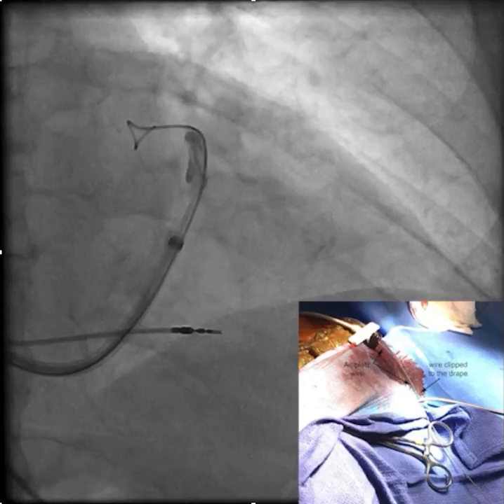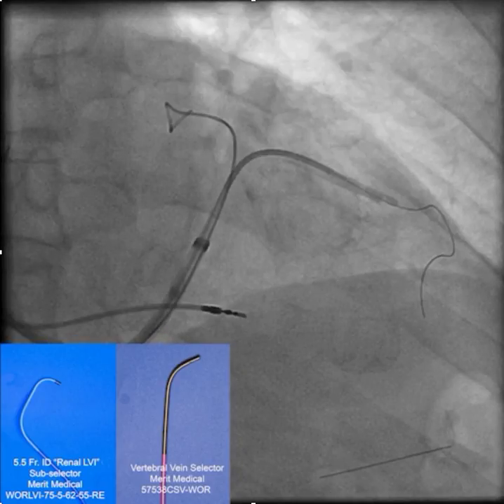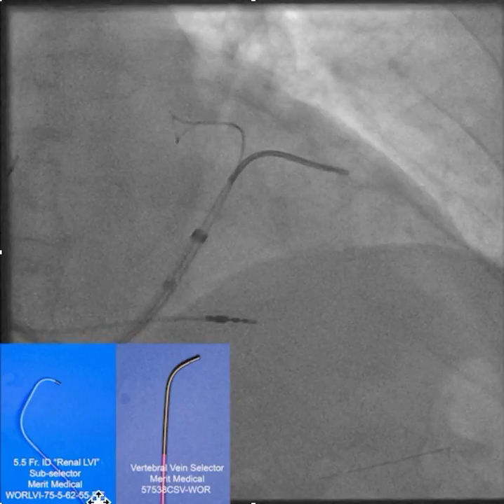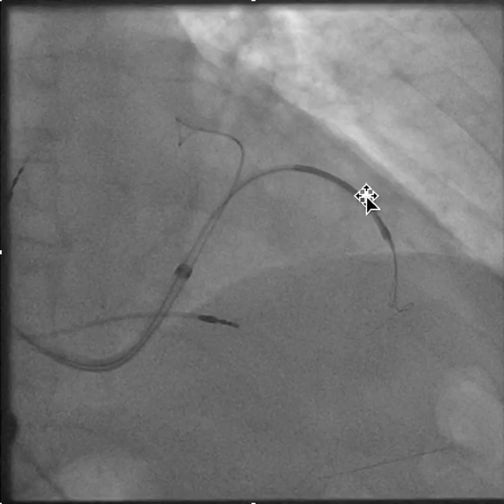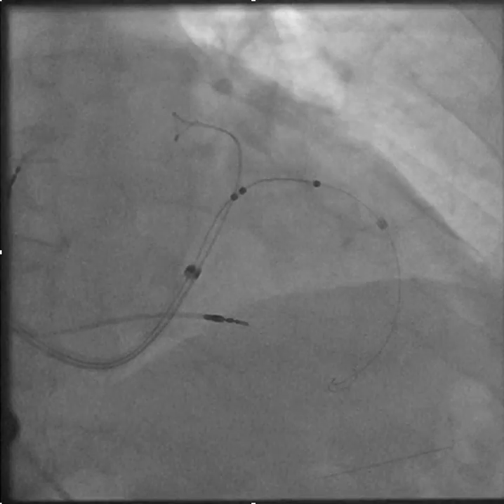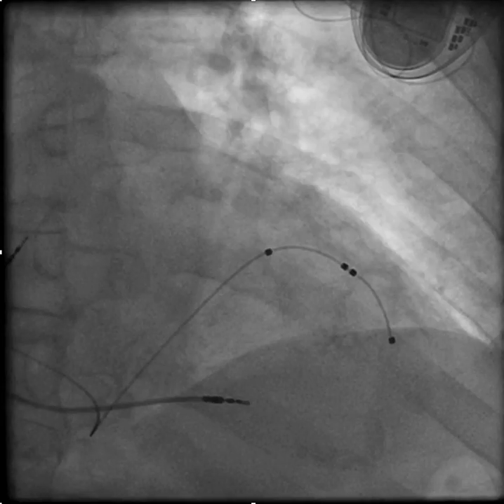With the Amplatz wire in place we do our venogram, then use the vein selector to engage the branch. Here we're going to use the vein selector to direct the wire into the side branch, then slide the sub-selector over the vein selector into that side branch so that we can deliver the lead directly into that side branch, which will keep everything more basal. And that's the result.